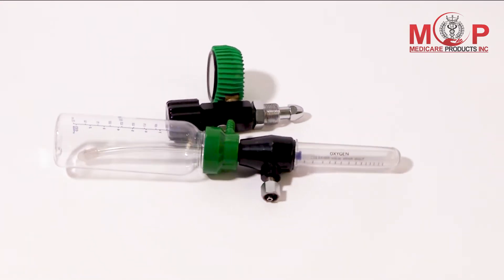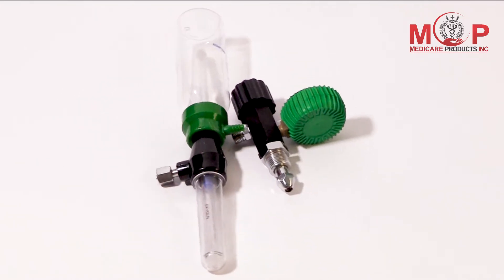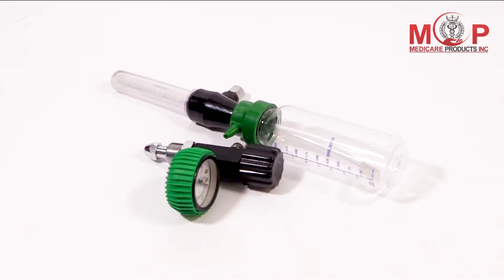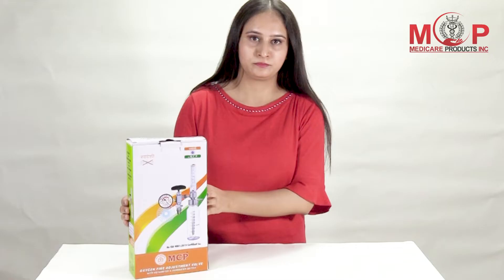Presenting the MCP Oxygen Flow Meter with Rotometer and Humidifier Bottle. The Oxygen Flow Meter is mainly used to regulate the flow of oxygen from the gas source so that it delivers an accurate prescribed flow.